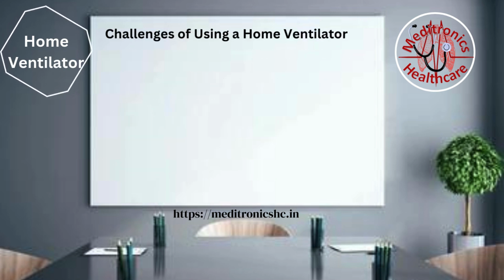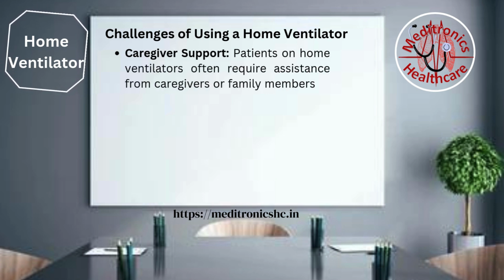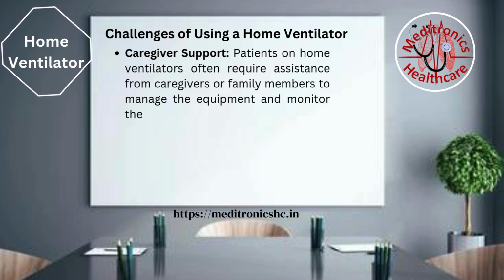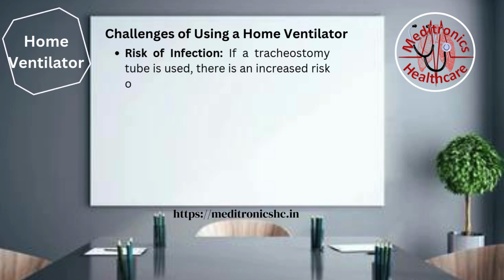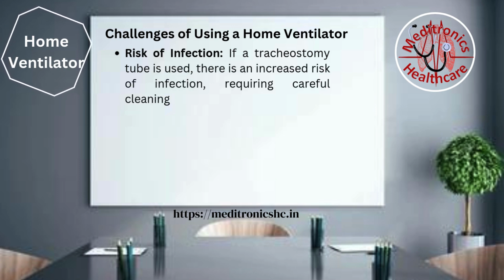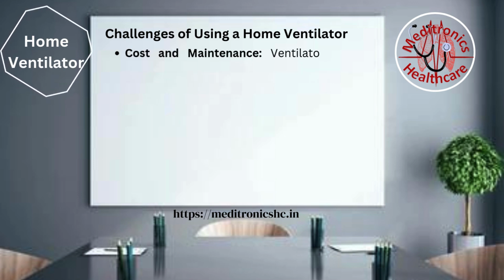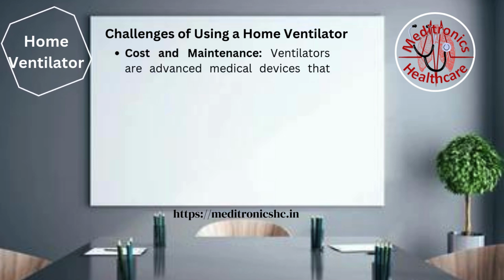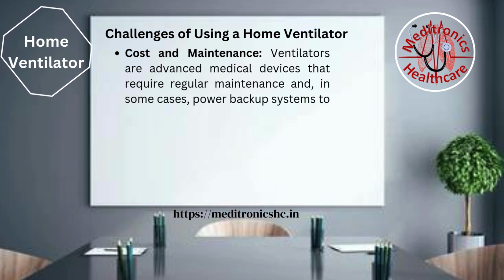Challenges of using a home ventilator. Caregiver support. Patients on home ventilators often require assistance from caregivers or family members to manage the equipment and monitor their health. Risk of infection. If a tracheostomy tube is used, there is an increased risk of infection, requiring careful cleaning and monitoring. Cost and maintenance. Ventilators are advanced medical devices that require regular maintenance and, in some cases, power backup systems to ensure continuous operation.